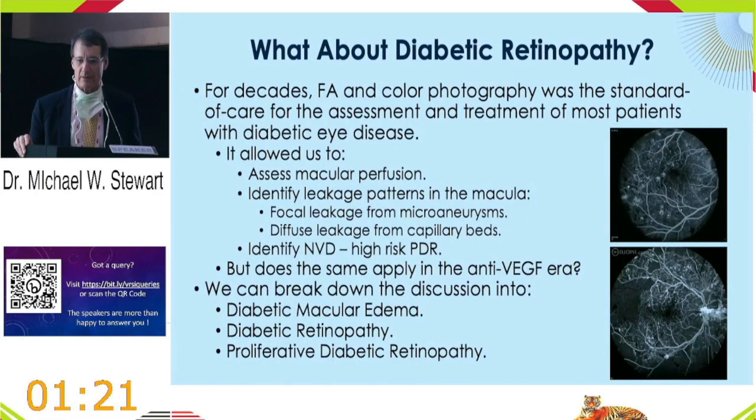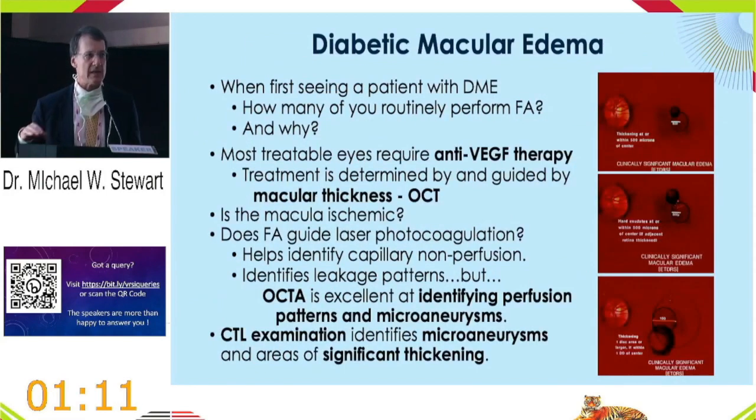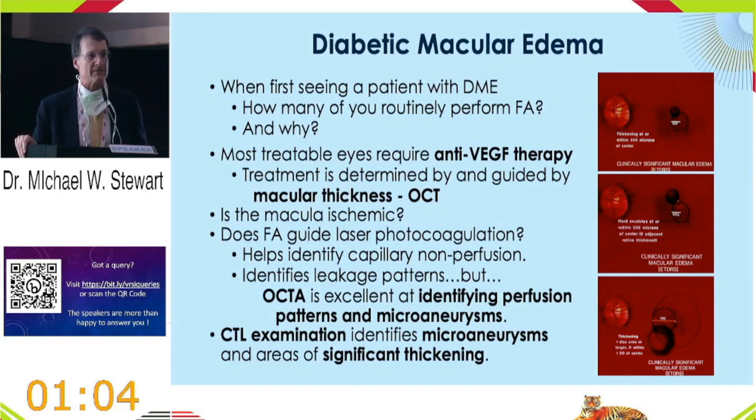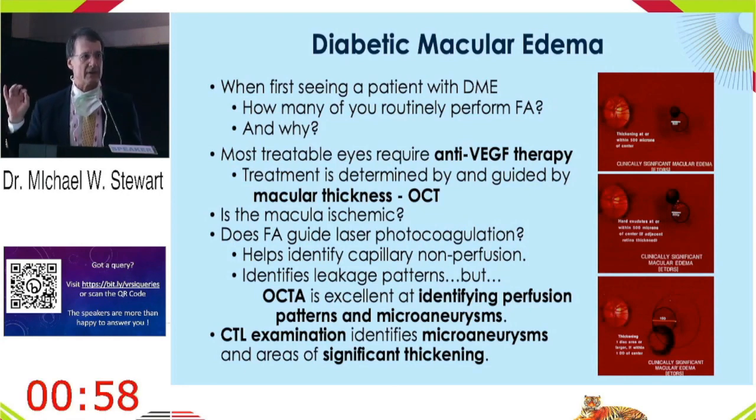So what about diabetic retinopathy? Well, for decades, fluorescein angiography and color photography have been our standards. But let's look at the three different versions of diabetic retinopathy and see how OCTA and dye-based angiography come into play. So diabetic macular edema, I think most of us would agree that fluorescein probably doesn't contribute a whole lot to the treatment of diabetic macular edema.